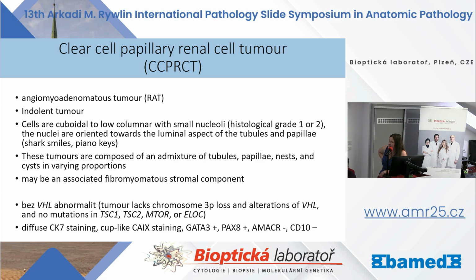The tumor typically lacks genetic abnormalities, so there is no VHL abnormality, and no mutation of VHL, TSC1, TSC2, mTOR, or ELOC. Again, there is an overlapping immunohistochemical profile. CK7 positive, there is so-called cup-like positivity for carbonic anhydrase. These tumors are typically positive for GATA3.